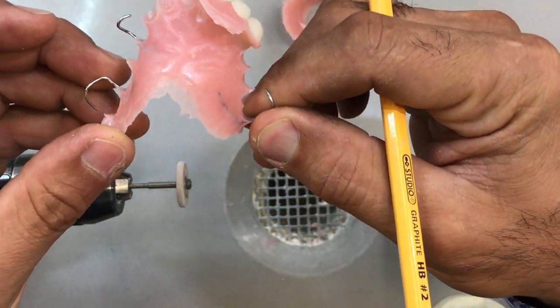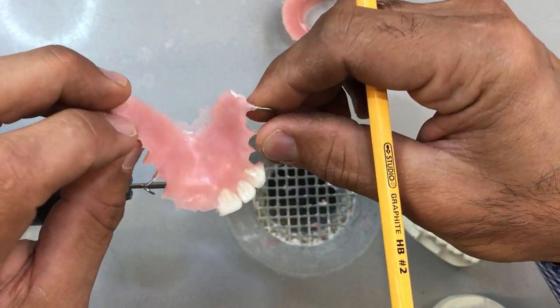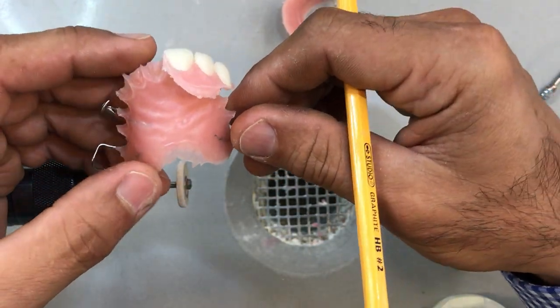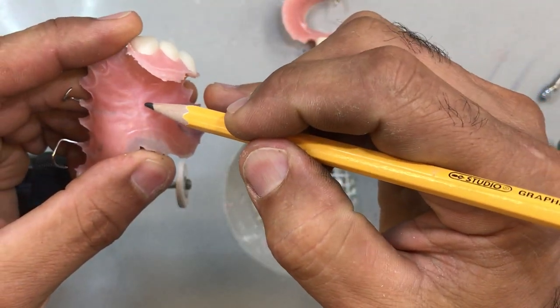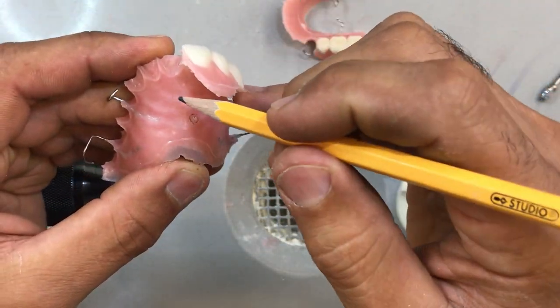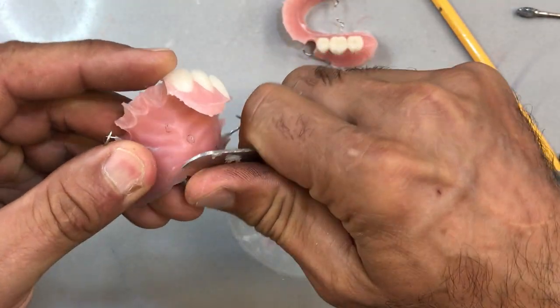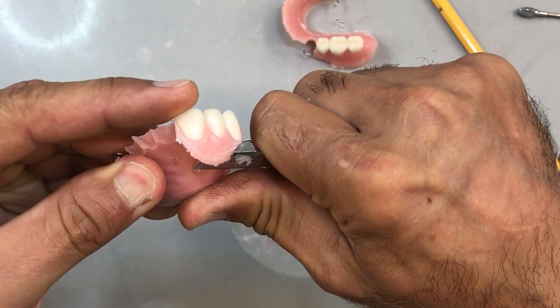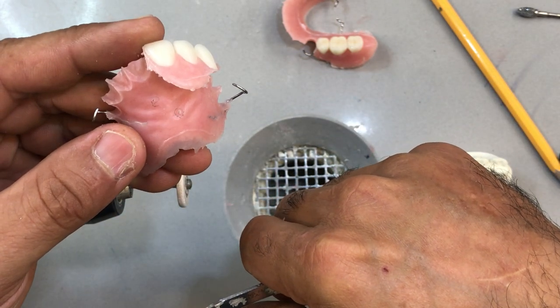Same thing with the upper — free of stone. There are a little bubble and some small projections here. You can grind these off or sometimes just pick them off if you can. I'm going to use a very small burr to grind that away.